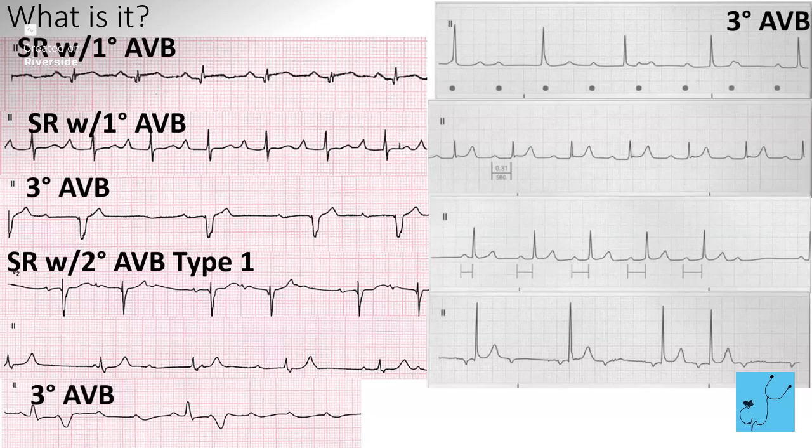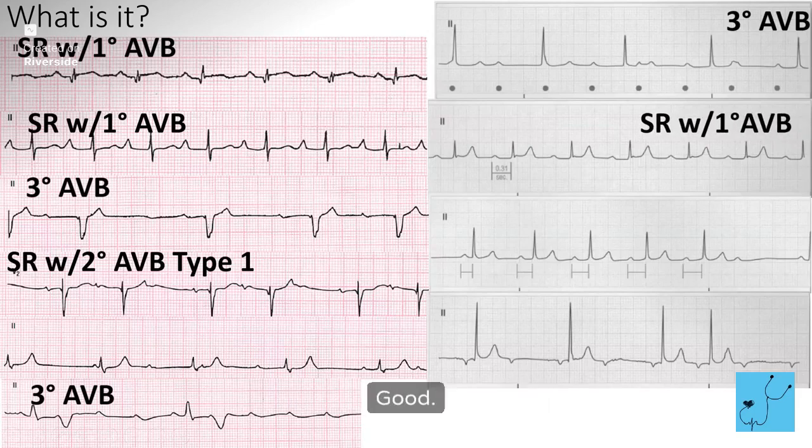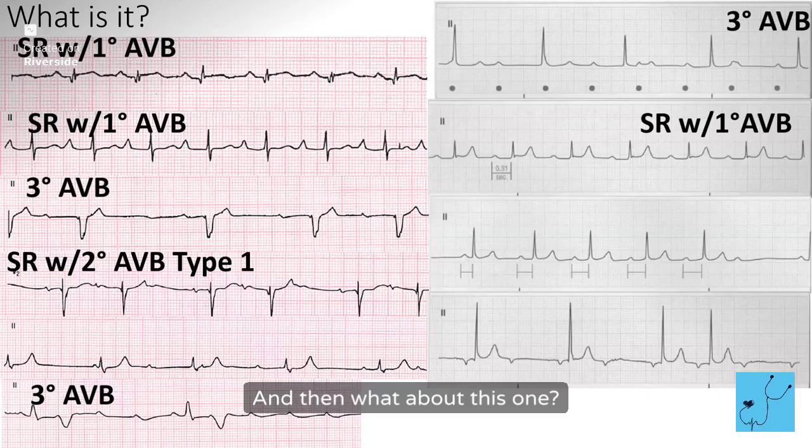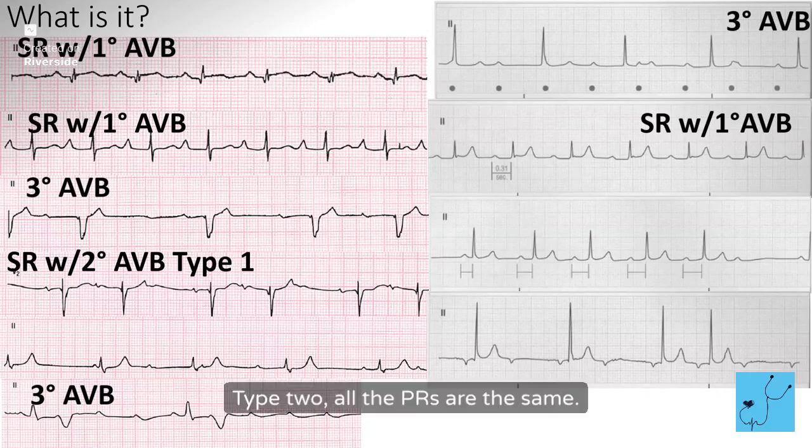Yeah, the PRs all look the same. They're all prolonged. Good. And then what about this one? Good. Type 2. All the PRs are the same.